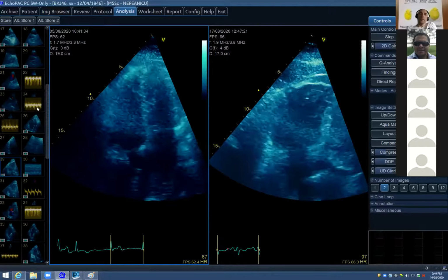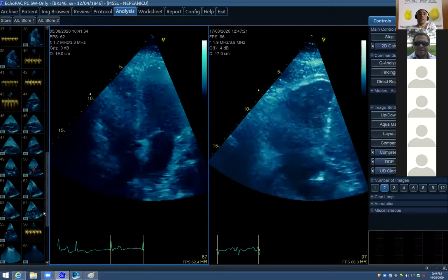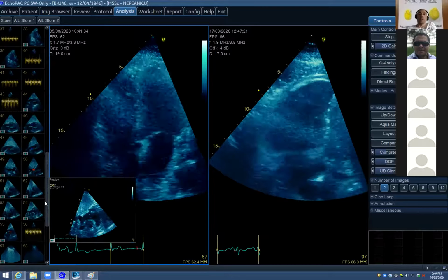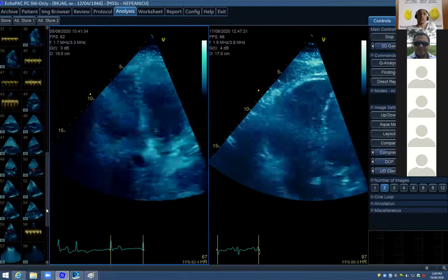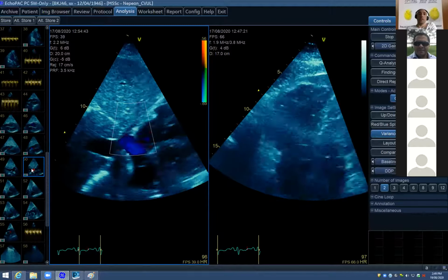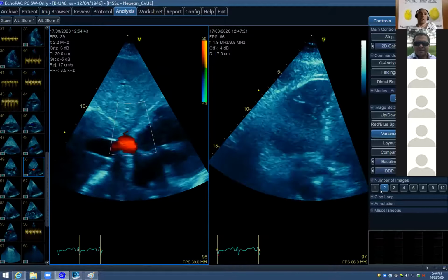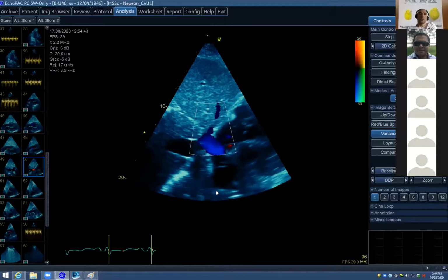Very nice. Yeah. What's amazing? Sorry. Oh no, I didn't mention the relative size. It looks like the RV would be severely dilated now, and it is moving towards apex forming, assuming that's on axis. Yeah, and it takes over most of the RV.